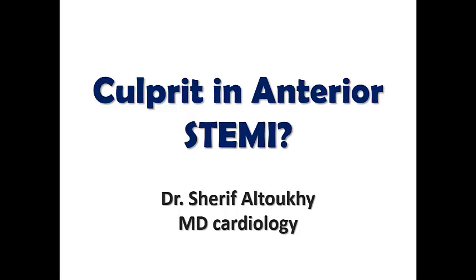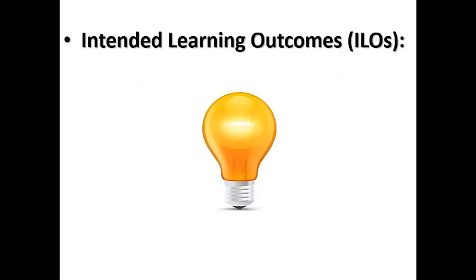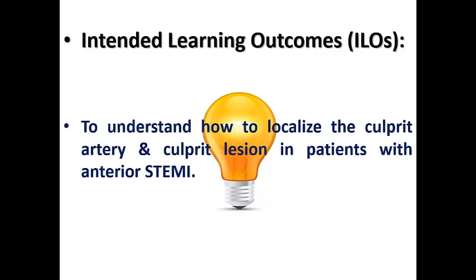Hello everyone and welcome to the first of the 3 lectures in the localization of myocardial ischemia after the introduction, and we are starting with culprit in anterior STEMI. Here we are going to learn how to localize the culprit artery and culprit lesion in patients with anterior STEMI.